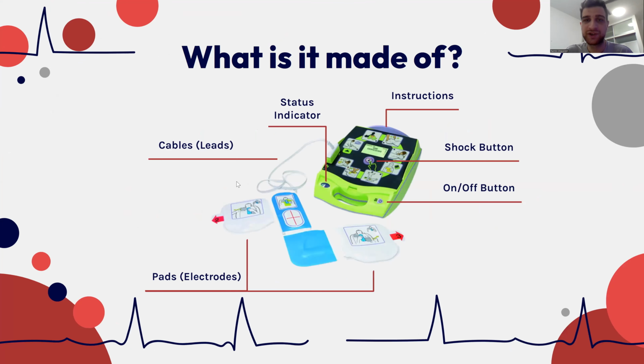Starting with the theory, we first need to learn what is the instrument exactly made of. So it has a main body which includes the battery packs. Usually it has instructions of use written on it. It has a status indicator for the readiness of the charge, a shock button, an on and off button, cables that will carry the electric shock to the electrodes, which are covered by pads, which have instructions on where to place them drawn on them.